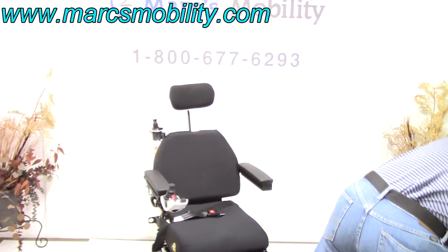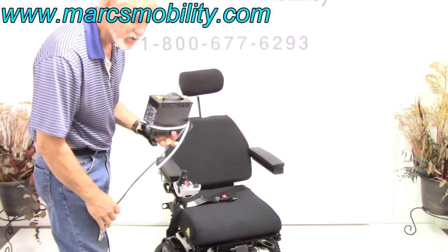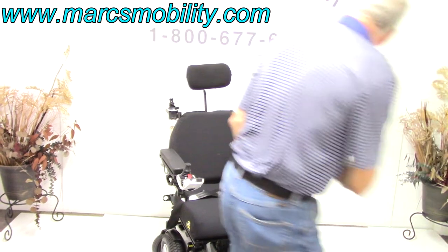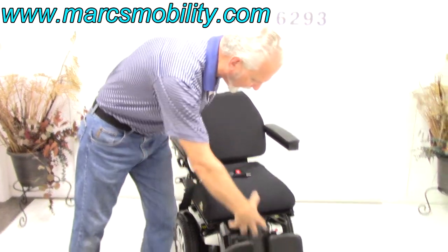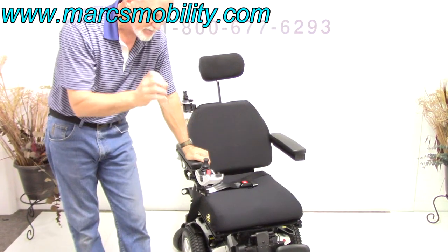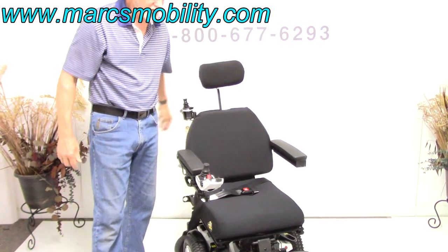When you charge this chair, take your charger and plug it right in here. As soon as the light turns from orange to green, you're fully charged — the charger will stop charging automatically. This chair has two batteries; they're group 22, 55 amp batteries, and they come out from the front. You have to have the seat tilted or the legs out of the way to get the batteries out. Don't let your batteries die, because once they're dead you won't be able to get them out unless you have a technician do some finagling from the back.